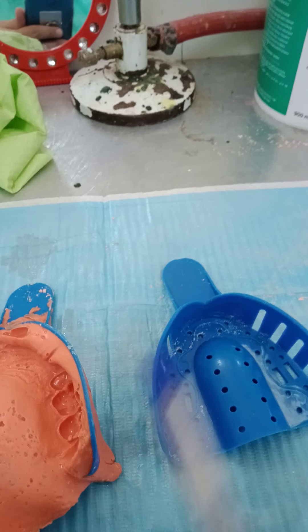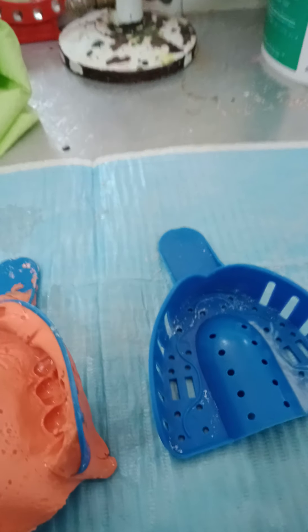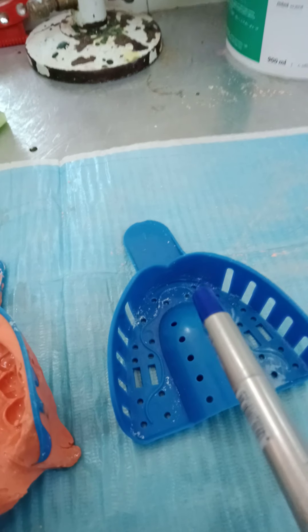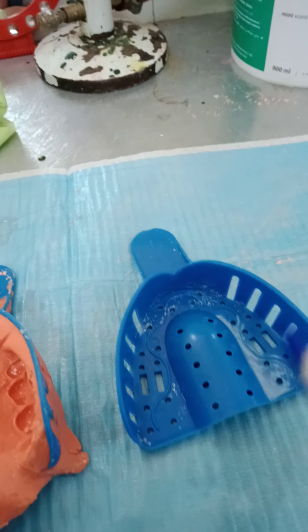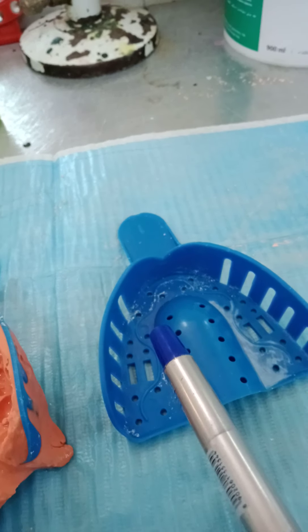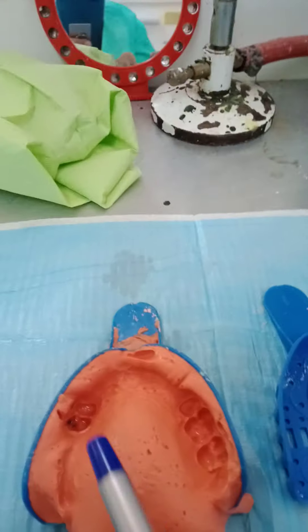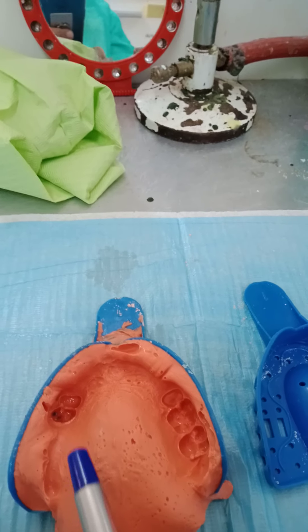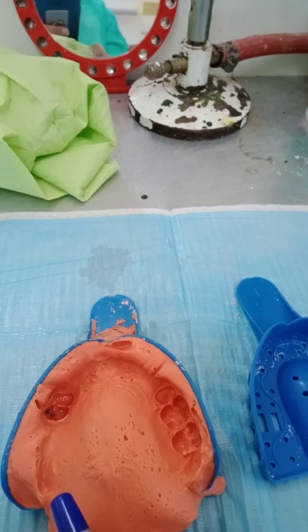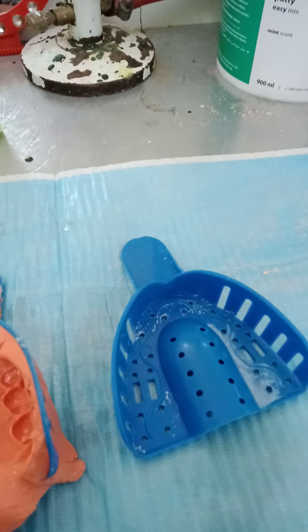Over all of this, I'll place an adhesive spray, and once it dries out I take a regular alginate impression. What will happen is that where the compound is, the alginate will be thin and wash away. So what does the alginate record? It records the teeth, the undercuts, the remaining soft tissue, and the soft tissue around where I'm going to do my post-dam. So I don't need a special tray — I use two materials. Compound in the saddle area: border mold and compress. Another piece on the second saddle: border mold and compress. Once finalized, spray adhesive and take an alginate impression over everything. It's a two-step impression with two materials, and this compensates for not having a special tray.